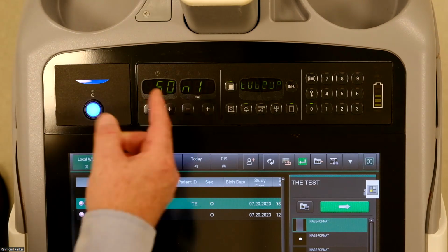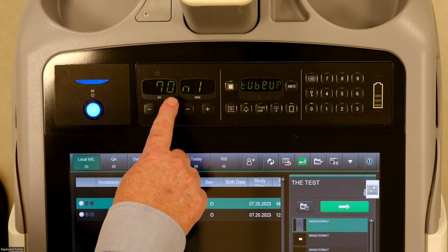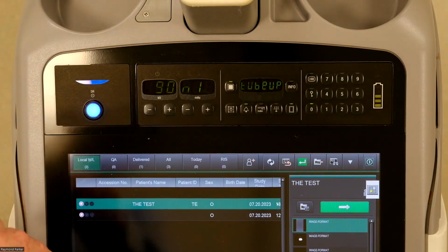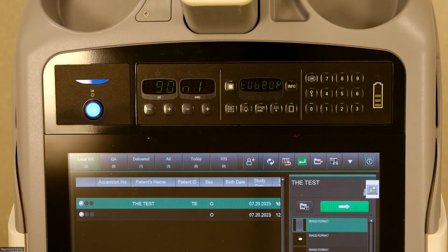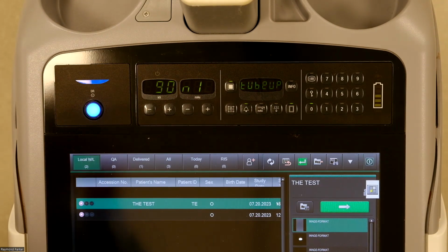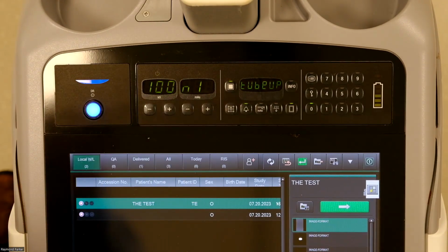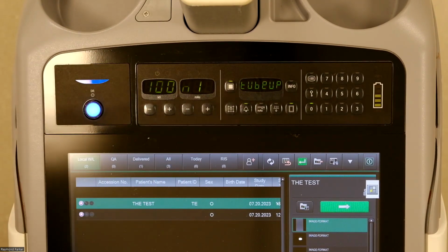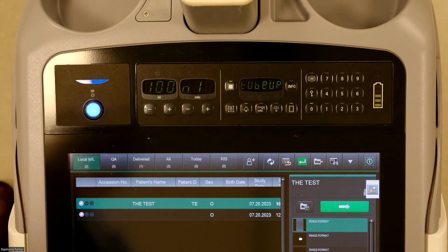When discussing this with my customer, I will ask them to start at 80 and make the exposure. Immediately, the system will jump to 90, and then 20 seconds later, you'll be able to take your second exposure. It will immediately jump to 100, excuse me. And then 20 seconds after that second exposure, you would be able to shoot your third shot.